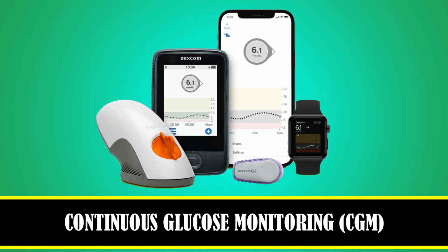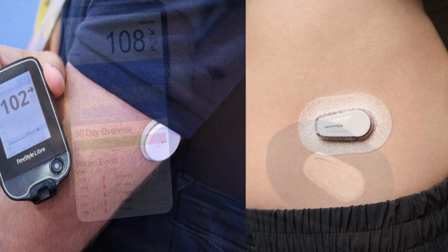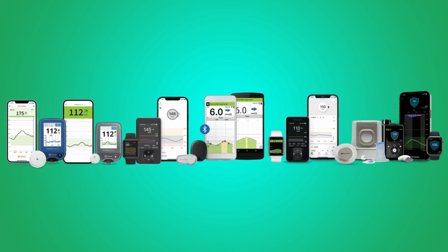So let's look at the continuous glucose monitor, known as CGM. With this CGM, the sensor is usually applied to the underside of the arm or belly and sends blood sugar readings to your smartphone or reader automatically via Bluetooth, at least up to every 5 minutes or every 1 to 15 minutes, depending on the device, as some CGMs are more accurate than others.